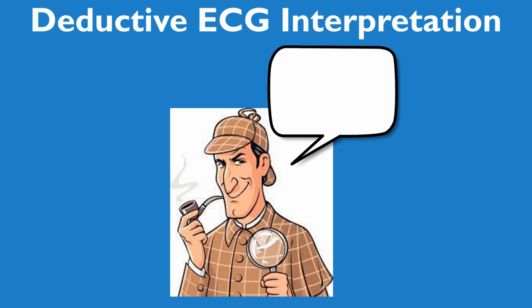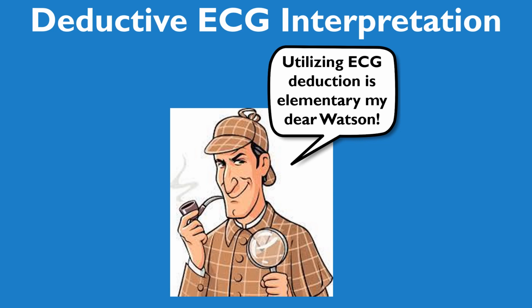The EKG Detective is dedicated to helping healthcare professionals make the transition from using inductive EKG interpretation skills to deductive EKG interpretation skills. If you're interested in finding out the differences between the two, I would encourage you to go back to the first video where we spent a little bit of time talking about the differences between the two. But for this series, I am going to follow Sherlock Holmes's lead and tell you that once you use EKG deduction, it becomes elementary in the aspect that it is much easier to wield and utilize when you're trying to interpret what an ECG rhythm is.